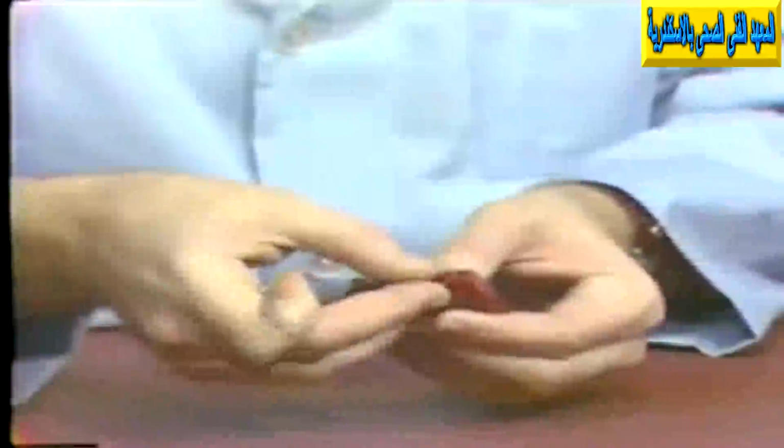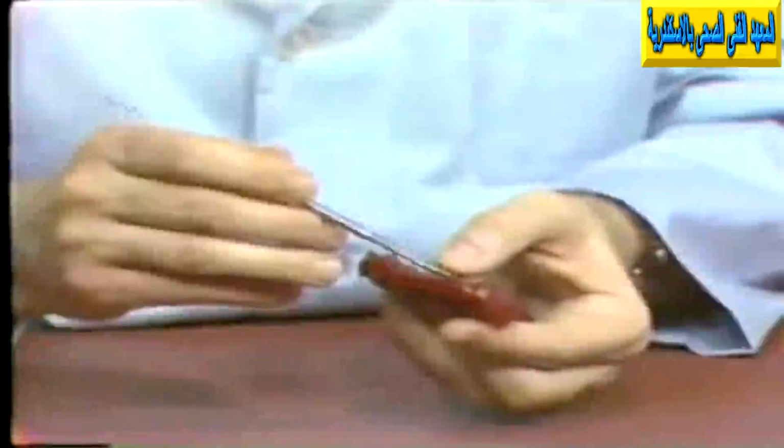So let's get that wax strip up where it belongs, a millimeter or two below the border of the impression. And again, simply by heating the number 7 spatula, the wax is sealed to the impression so the mixture of stone does not escape.